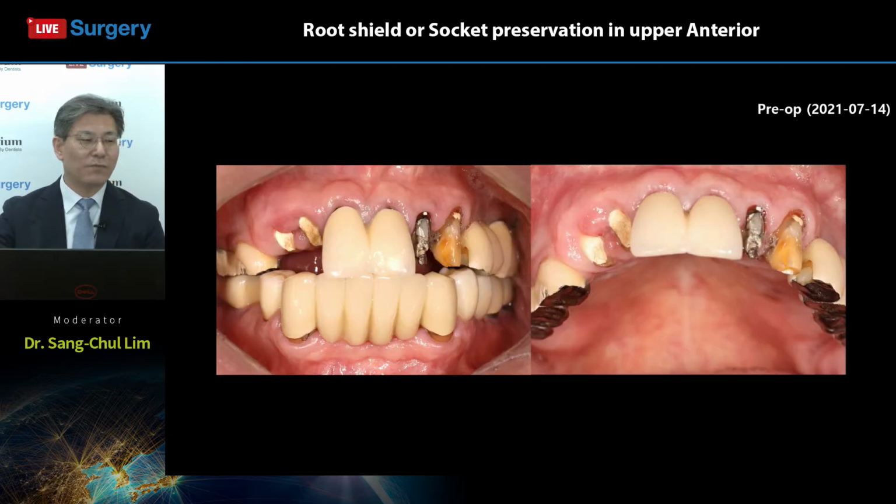This one is the intraoral view of the patient. As you can see, there is a longer clinical crown due to reduced periodontium, periodontal and soft tissue recession. Number 12 and number 13 teeth are already fractured, with remnants of the root. And we can see the gingiva is swollen and has some inflammation around this root remnant. And around tooth number 22, 23 areas is also not a good situation.